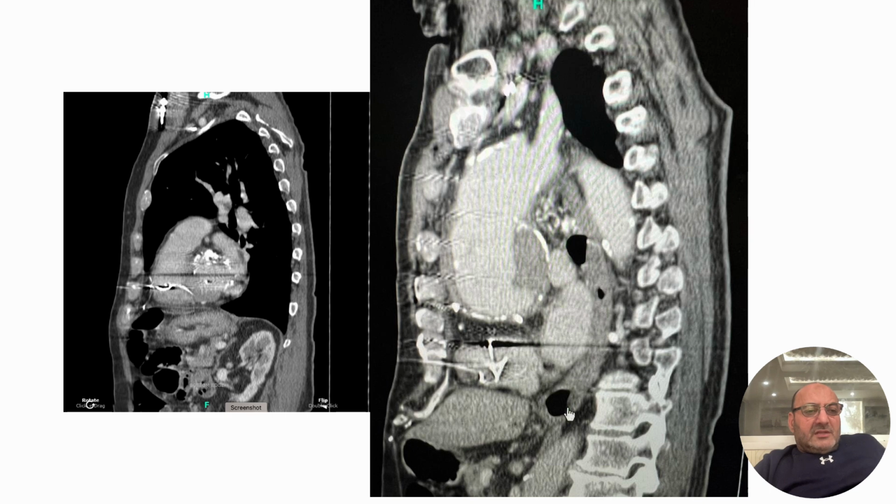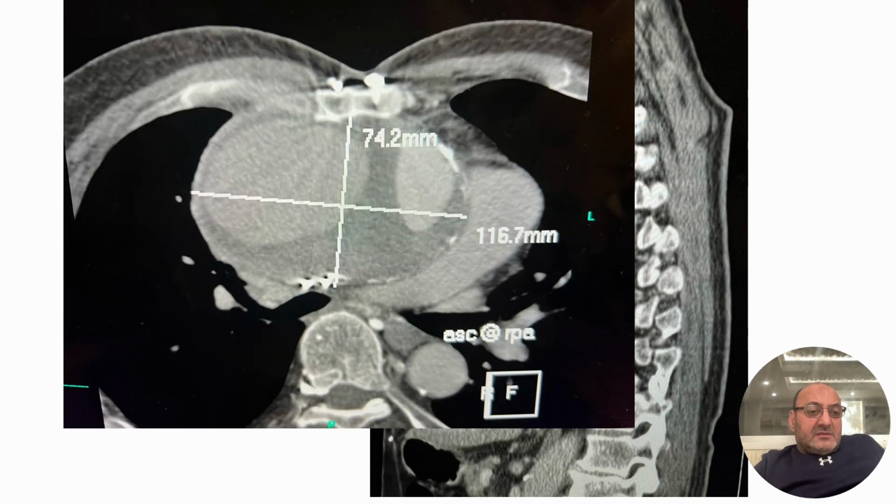It's very challenging technically. You almost have to put the patient on circ arrest right away, through a fem cannula, and you can go in there. But having a stent graft is a blessing if it's feasible. So in this case, as you see, it's a very, very large pseudoaneurysm here.